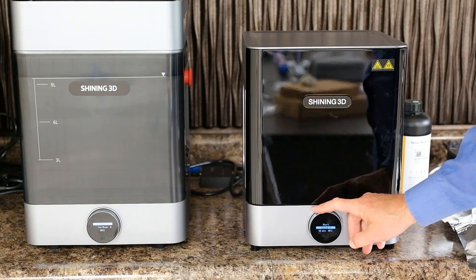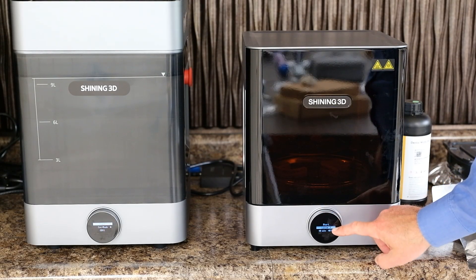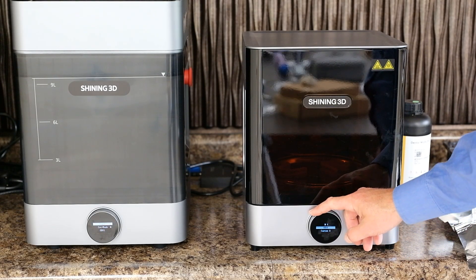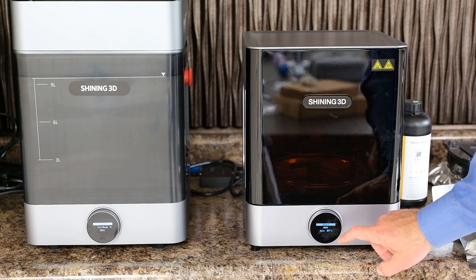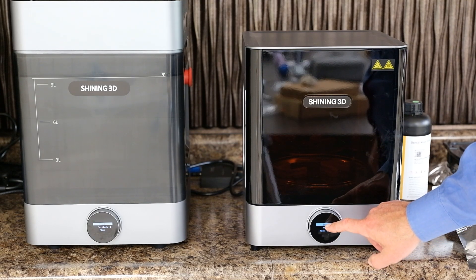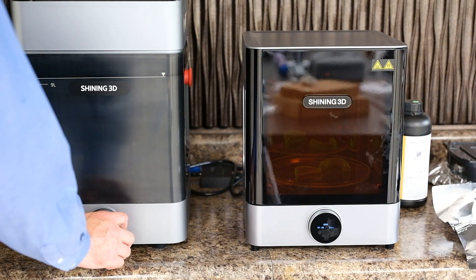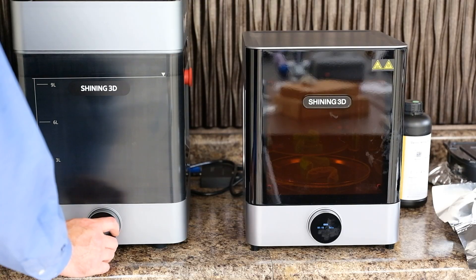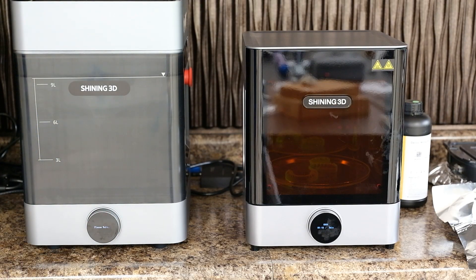Then I load them into the FabCure2. I'm going to make sure I select the resin I used to print with, and then I'm going to start. Once you start the curing process and have selected the resin you used, it'll automatically select the time and whether or not the unit needs to be preheated. The curing process takes about seven minutes for model material, and when this is done, we'll have our final models.